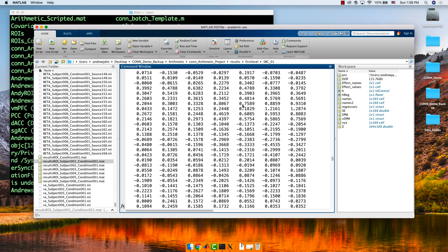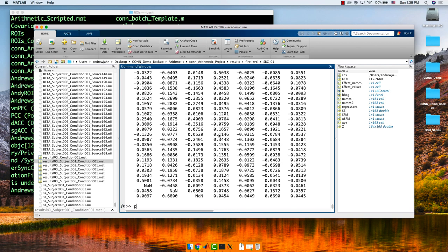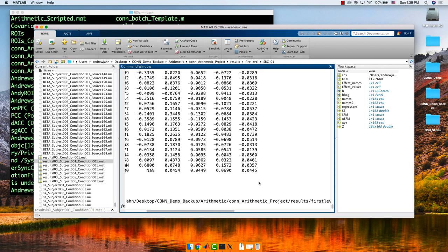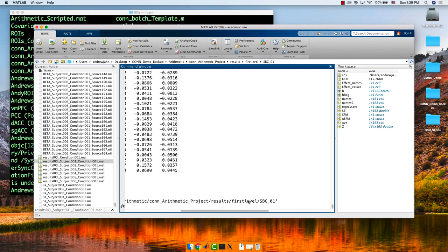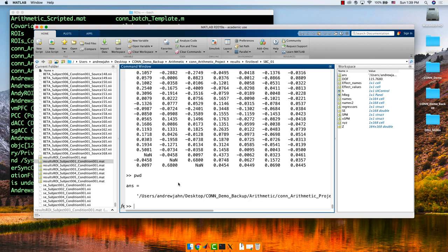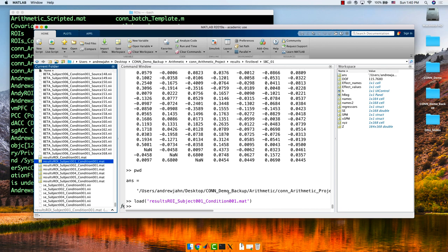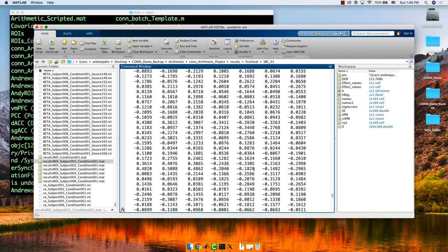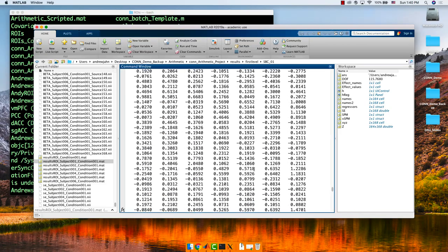As I mentioned during the break, this is actually a pretty good thing to mention. Within the MATLAB terminal, in the project directory under results, first level, SBC01, there are all these different .mat files — sub01, sub02, sub03, sub04, sub05, sub06. We've run all the first level analyses for them. If you simply double-click on one of them, it loads up the mat file and also creates this Z variable. What's in Z? It's a ROI-by-ROI matrix.